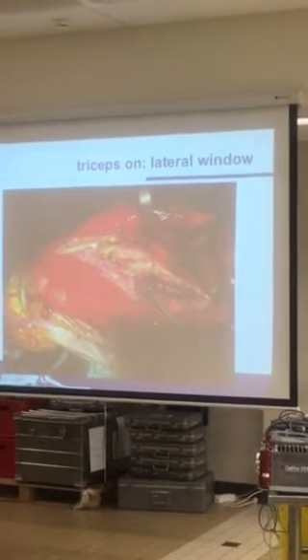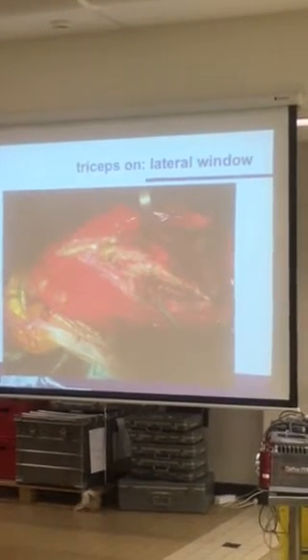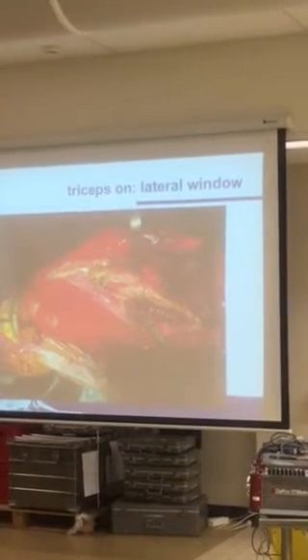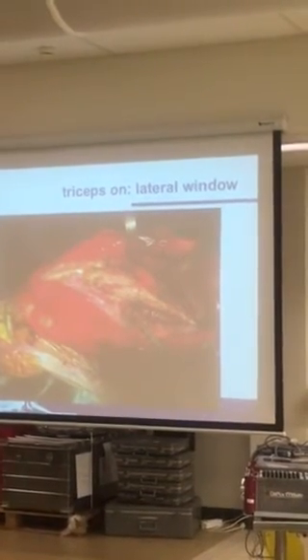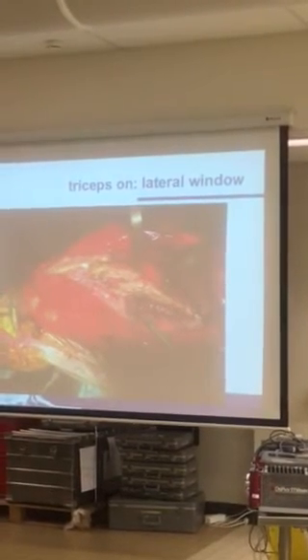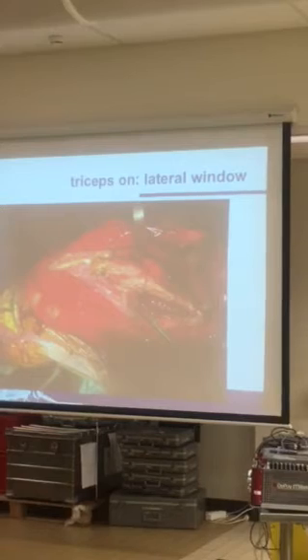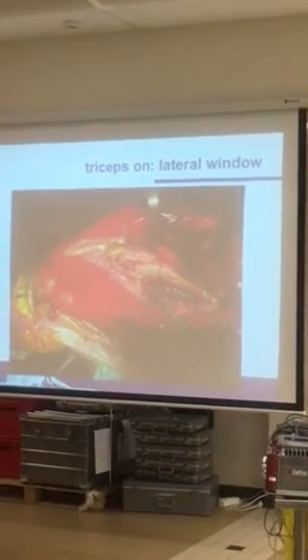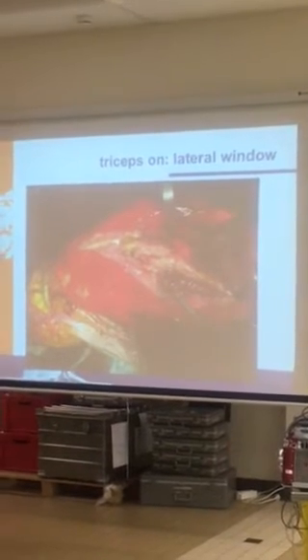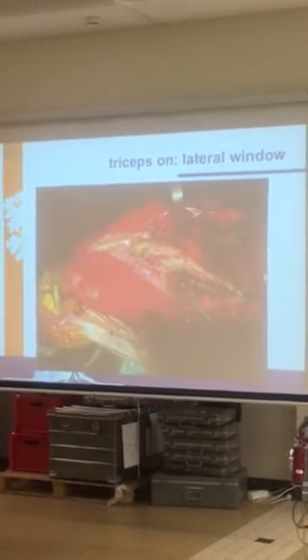So we go further, and you create a lateral and medial window along the triceps. You should do that if possible. Create a lateral window along the lateral column and a medial window along the medial column of the triceps. Then you go in and do a complete capsule release on the posterior and anterior side. When you finish with that release, you can dislocate the ulna and radius from the humerus.